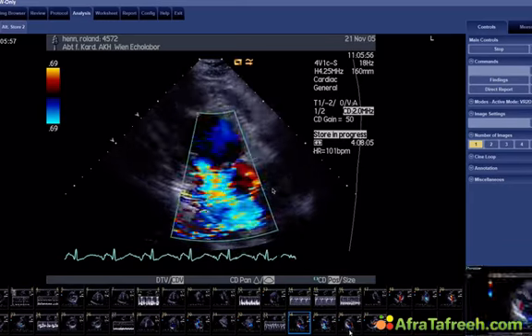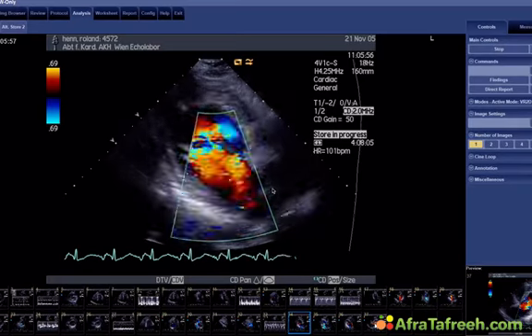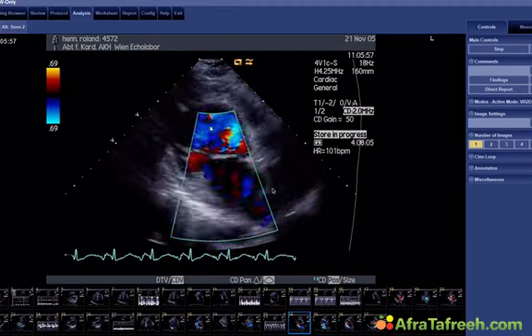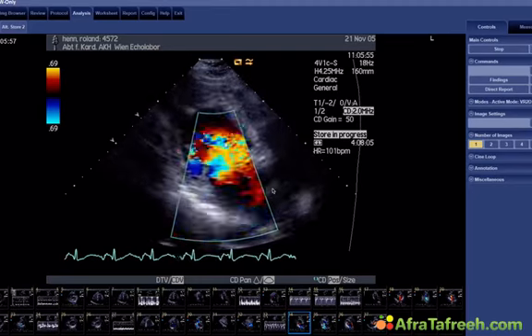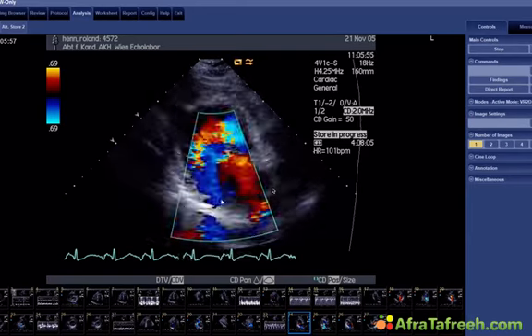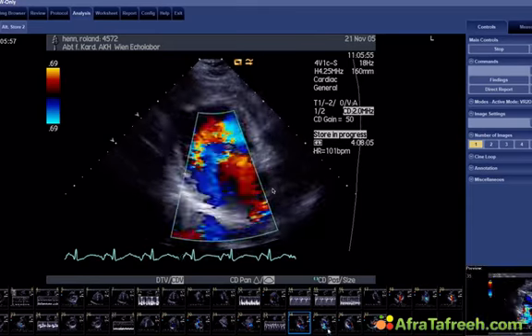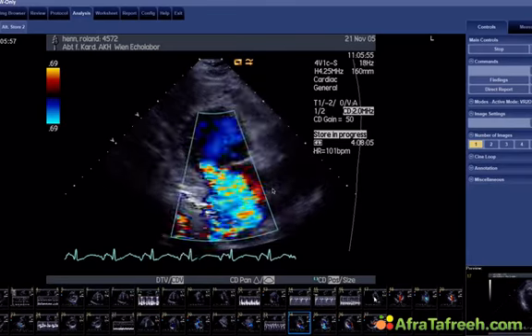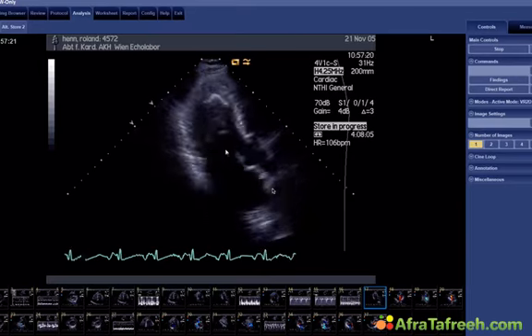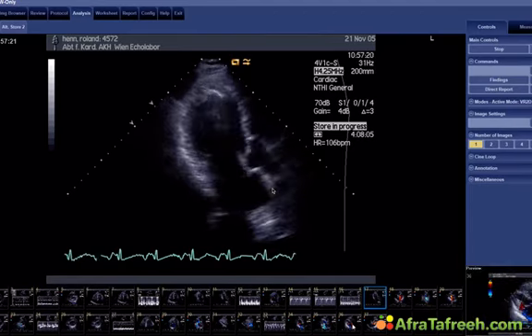So what do we do with this patient now? We have a patient who has hypereosinophilia with a restrictive cardiomyopathy, still good left ventricular function, and very severe mitral regurgitation. And the other question is, why does the patient have mitral regurgitation? We do not really see any pathology on the mitral valve. At least I didn't. This is, again, the apical long axis view. Okay, we can't see the mitral valve very nicely.